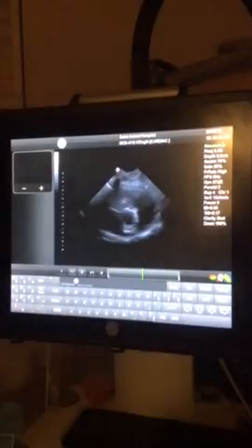We do want to hit OK here because if you just hit review, it won't let you add anything to that folder itself. See, little details. So when we select Monkey, we want to go to the button that says OK, because that will open up that case and let us go ahead and add measurements or whatever we need to in there.